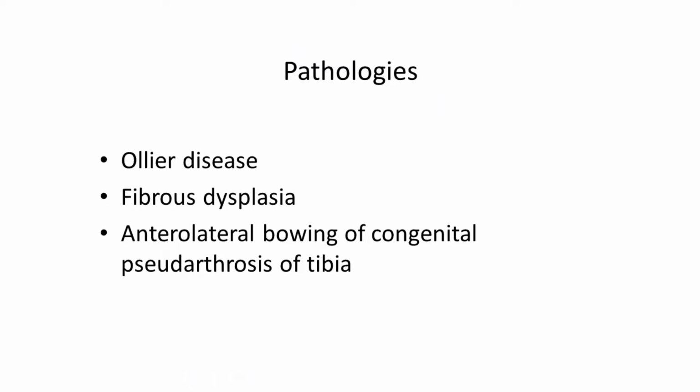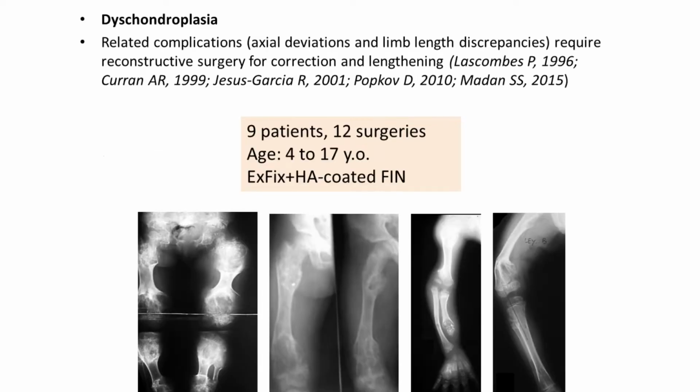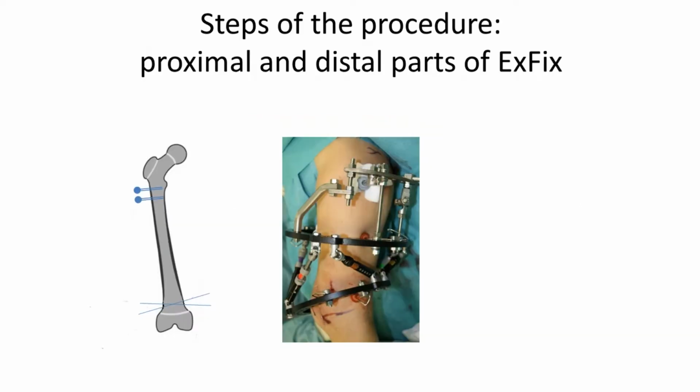In this talk, I'll demonstrate our results of use of external fixation with titanium or hydroxyapatite-coated intramedullary renailing in patients with Ollier disease, polyostotic fibrous dysplasia, and anterolateral bowing of congenital pseudarthrosis of tibia. You know that multiple enchondromatosis is an uncommon non-hereditary bone disorder. Intervention on the enchondromas seems to be insufficient, but early disease-related complications, axial deviation, and limb length discrepancy required reconstructive surgery for correction and lengthening. We have been using this combined technique for bone reconstruction in rare disease since 2004.